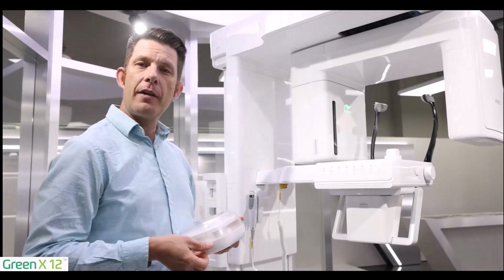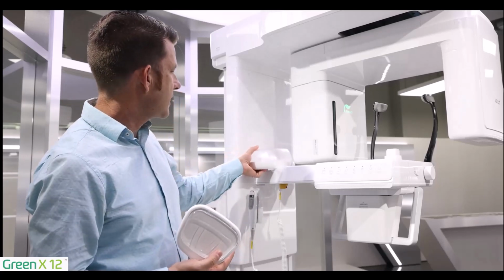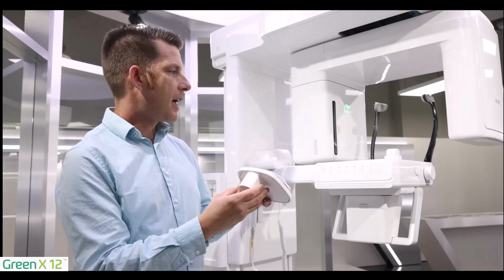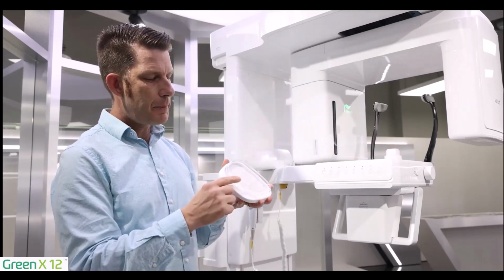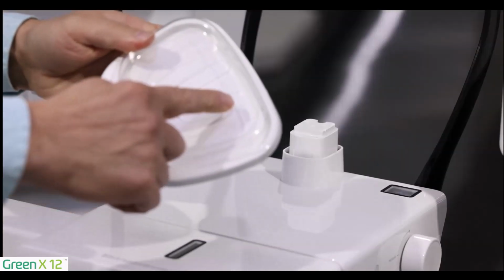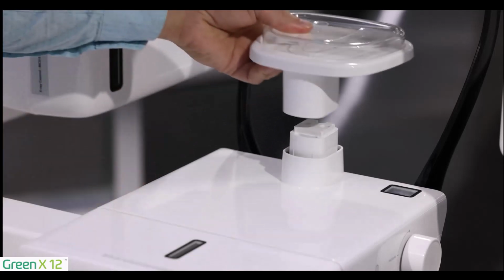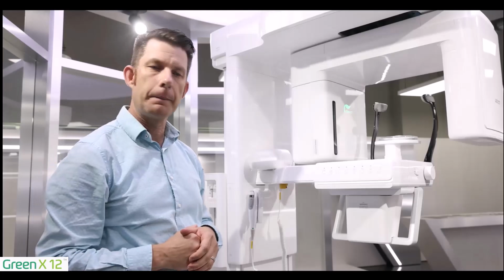Your model scanning platform comes in this case. Let's go ahead and set this here. So your model scanning platform will fit where the chin rest was. And if you notice on top of the model scanning platform, there's this clear plastic. This is where your cast model will sit. Simply place the model scanning platform in the device right there.